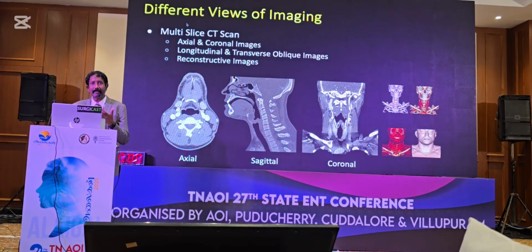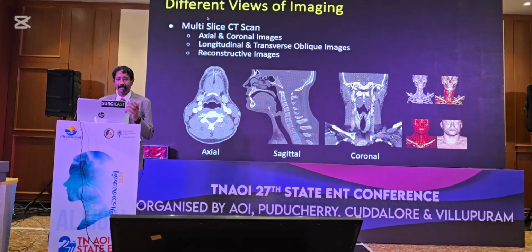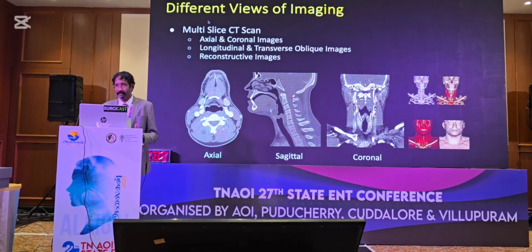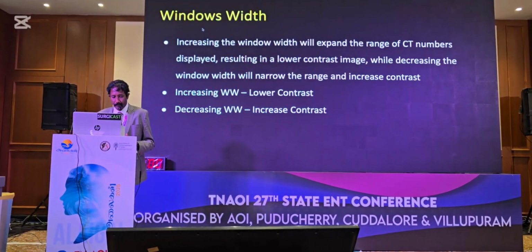So that's the clear coronal view. So both the positions it can be taken. Various reconstructions can be done like axial, coronal, sagittal, and reconstructive images can be done. It could be a plain CT or it could be a contrast enhanced CT.